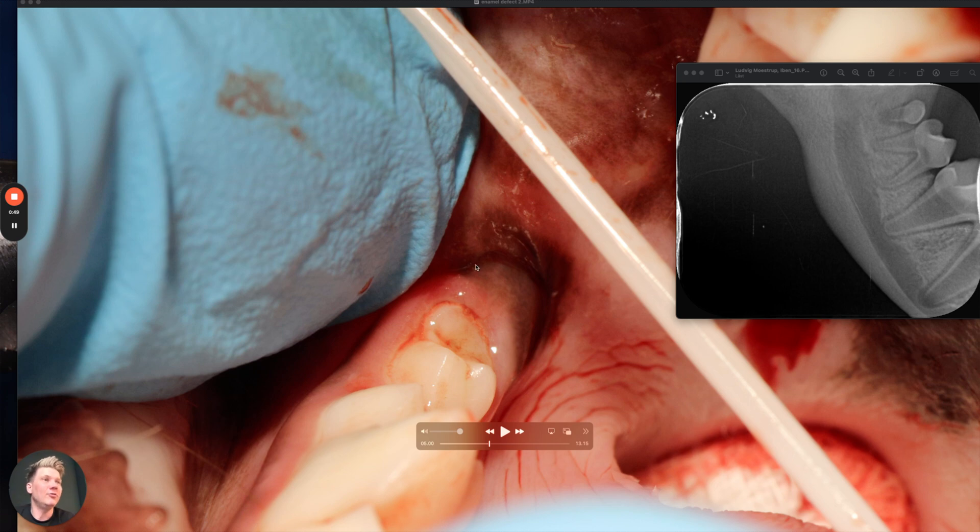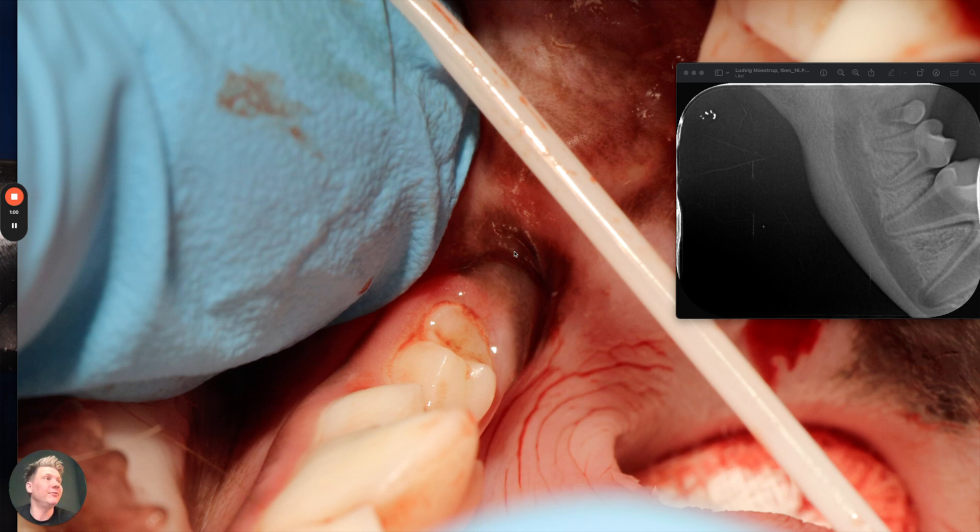Sometimes you can do an operculectomy, where you cut away a bit of the gum. You can use a small punch biopsy to do that if you want. But I didn't really rely on that to make this tooth erupt fully, so instead I decided to go in and extract it.